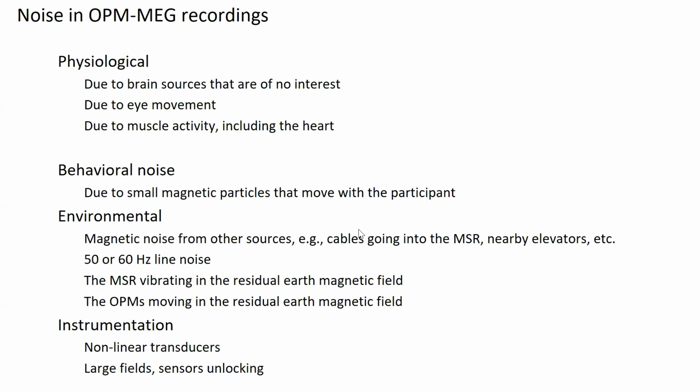The nonlinearity of the transducer, so the sensors that translate the magnetic field into something that is stored on the computer, is actually a little bit more challenging with OPMs than it is with SQUID. And it's also the presence of large fields, or relatively large fields, like more than, let's say, 10 nanotesla or so, which can cause artifacts with the OPMs that we're not so much used to seeing with the SQUIDs, because the sensors can unlock and can basically behave unexpectedly.